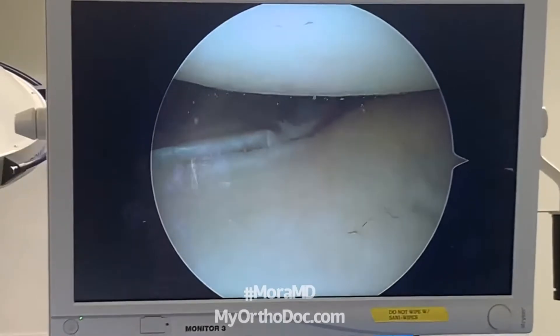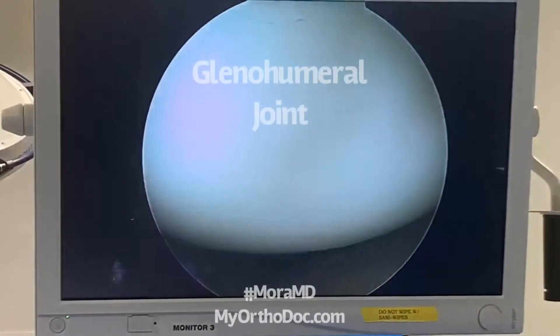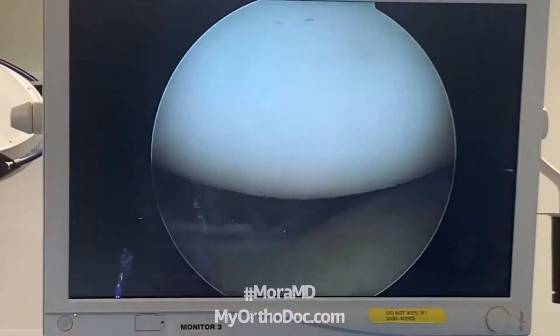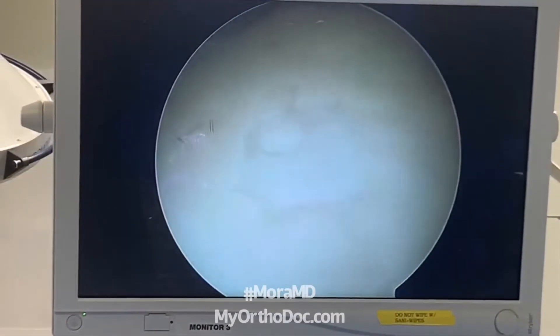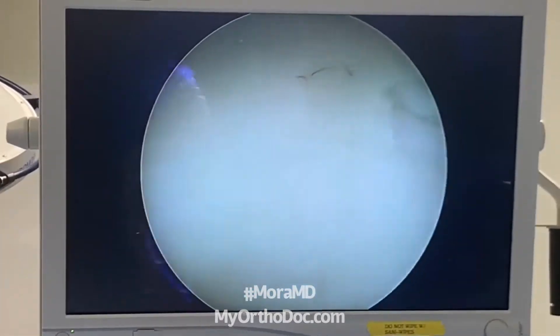Their ball-socket joint, also known as the glenohumeral joint. There's the ball — it looks gorgeous, looks like a cue ball or like a pearl. That's the way it's supposed to look. And then we look down — a little bit of degeneration right there on the center of the glenohumeral, but nothing too bad.